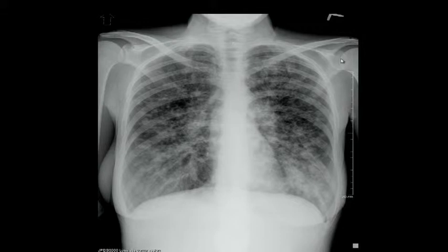So first thing I would say is that the lungs are hyperinflated. If I were to count the ribs, it's 1, 2, 3, 4, 5, 6, 7, 8. So we're seeing the anterior end of the 8th rib, so they're mildly hyperinflated. Would you agree? There's mild flattening of the diaphragm, mild, all right.